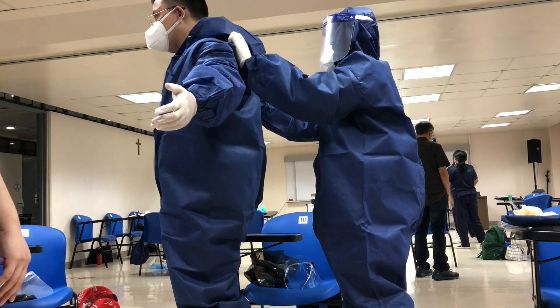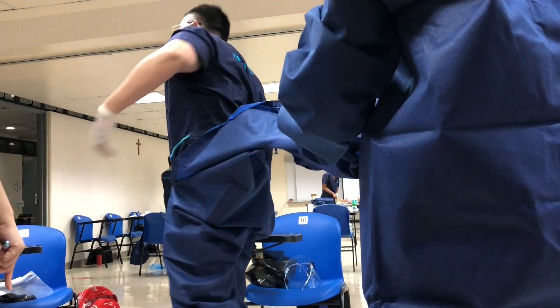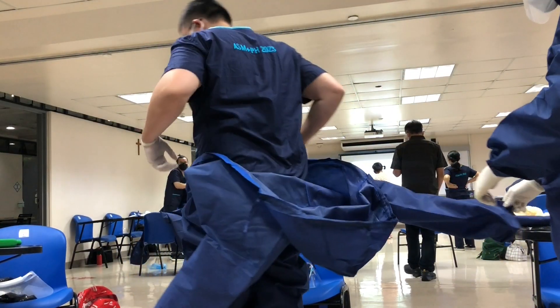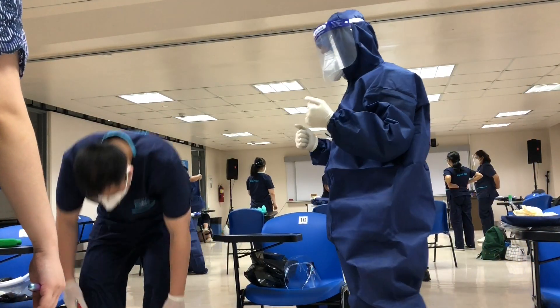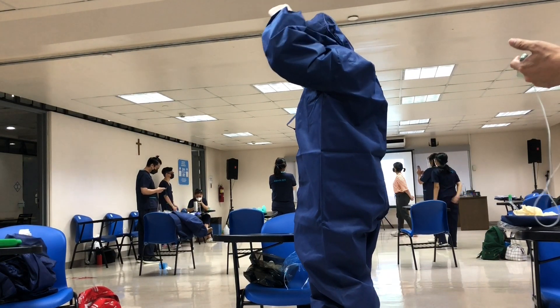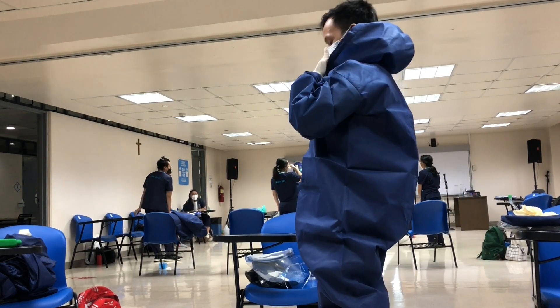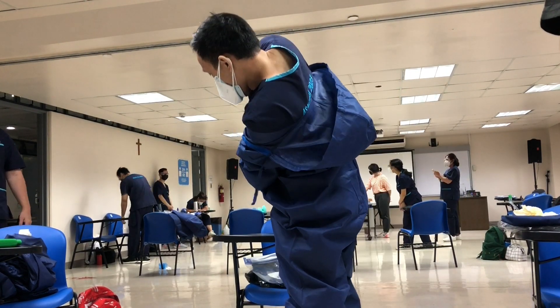Here you can see me helping my classmate out of his PPE, which is to simulate what to do if someone is having a hard time getting out of PPE by themselves. You don't take off your own PPE first — you first take off their PPE and wait for them to change before you yourself take off your PPE, so that you don't get contaminated by any pathogens that may have been on their suit.